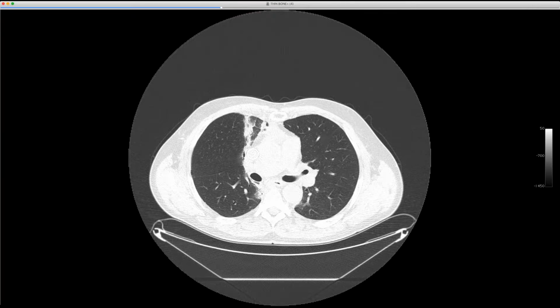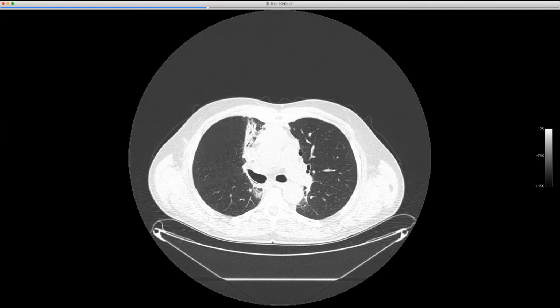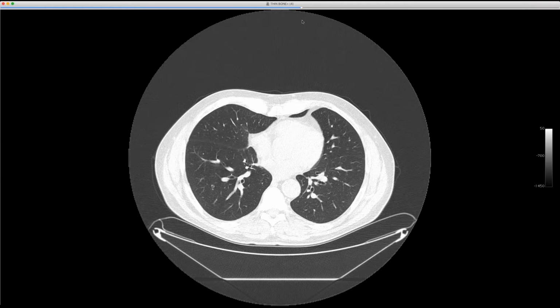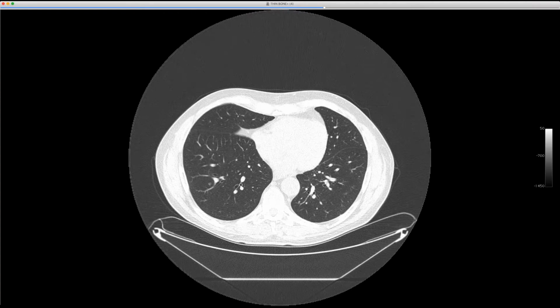This developed in what period of time? 3 months. I see. Yeah. Wow. The tumor itself is obviously responding to radiation. Presumably the chemo wasn't helping because these appeared. And I went back trying to find even an inkling of any of them, and they weren't there. So these showed up very quickly. I have not seen that appearance of them. All right, that's all I got.